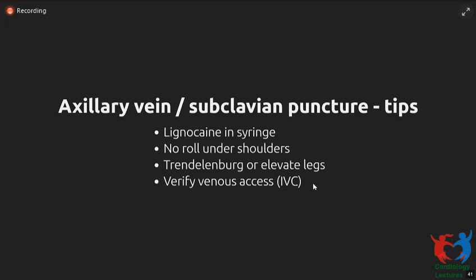It is always very important to verify venous access before putting in a sheath. Don't think that because when you aspirated, the flow was not pulsatile and the blood looked dark, this is a vein. That can be misleading in patients with heart failure who might have fairly deoxygenated arterial blood, and also where your needle might be slightly against a wall. If you do an inadvertent arterial puncture and your needle is against the wall, you may not get that much pulsatile flow. It has repeatedly happened in various places that people mistake an arterial puncture for a venous puncture and end up putting a lead into the artery and into the RCA and things like this.